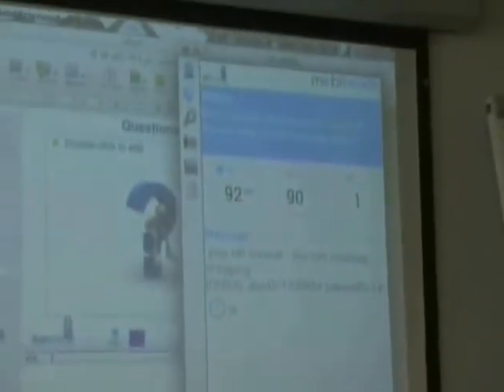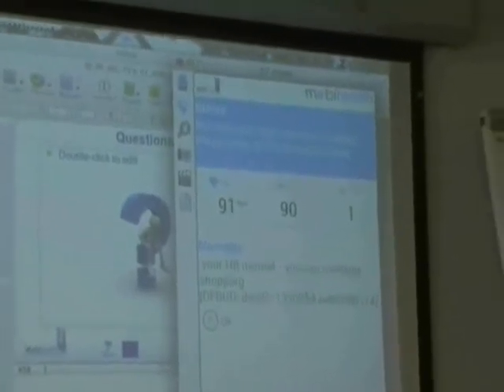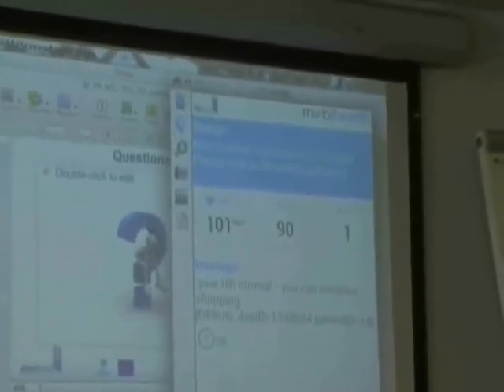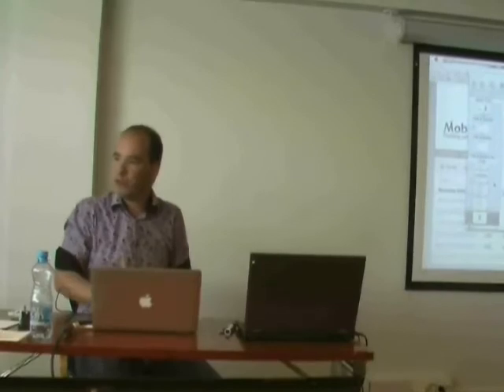So you saw here that it gives an impression of how to perform daily life activities within a safe boundary, and it gives also a way to incorporate personal context. By taking into account the specific levels which came out of the Bruce test, you have personal context, and of course it can be even more, based on location or time or even more non-medical related context.